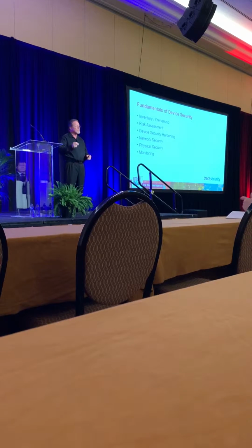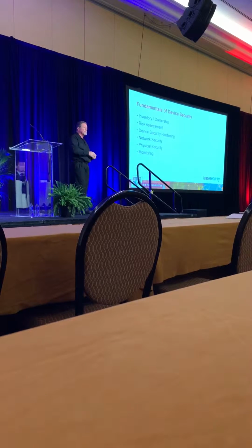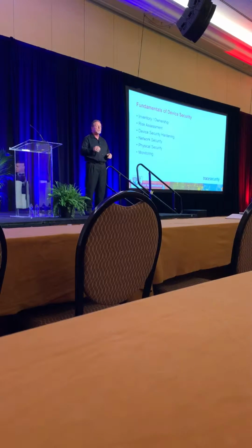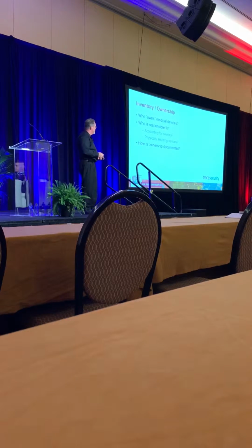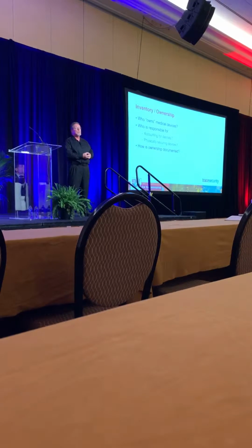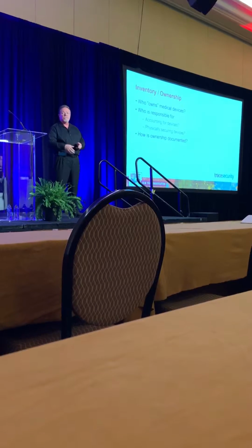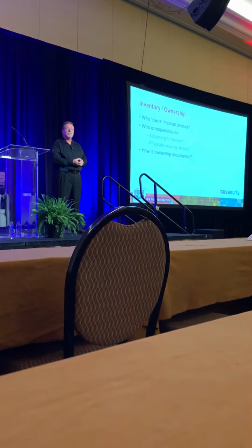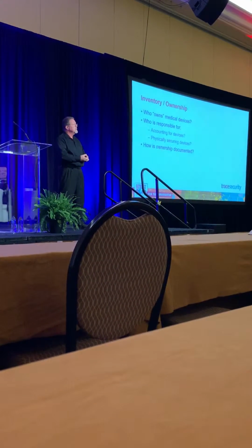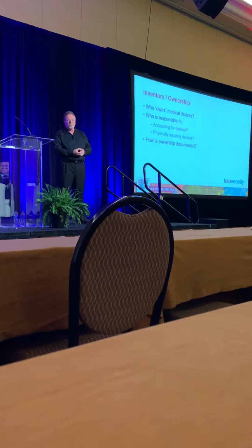Won't be able to go into some of them in depth, but I want you to understand that these are essential parts of a security program to help keep your medical devices secure. So we'll go ahead and start off with inventory. The thing about inventory is that if you don't know what you have, you can't protect it. You need to know what you have so that you know any vulnerabilities that are associated with those devices, and you need to be able to track those and keep an account for them.